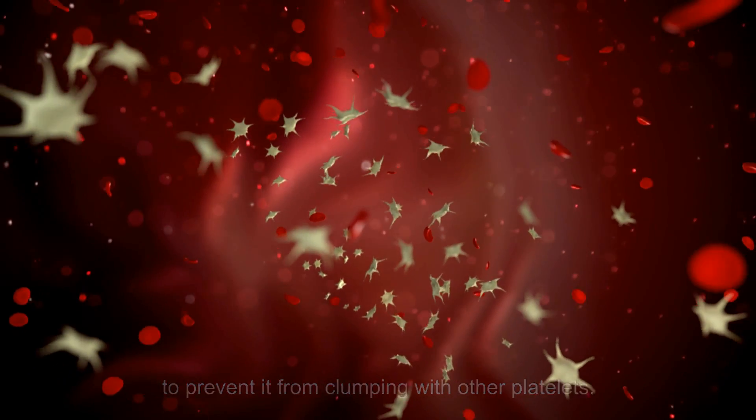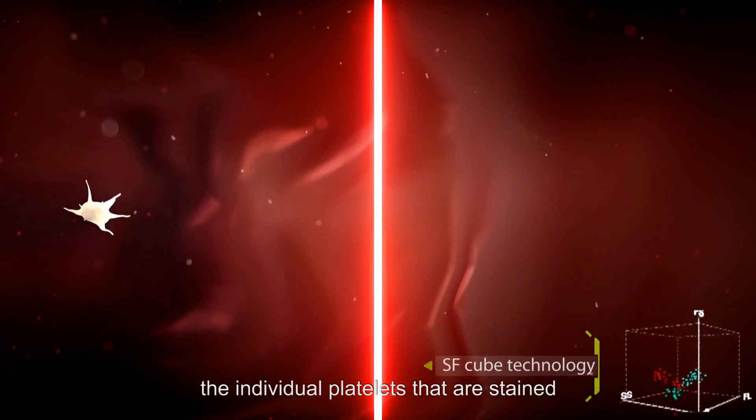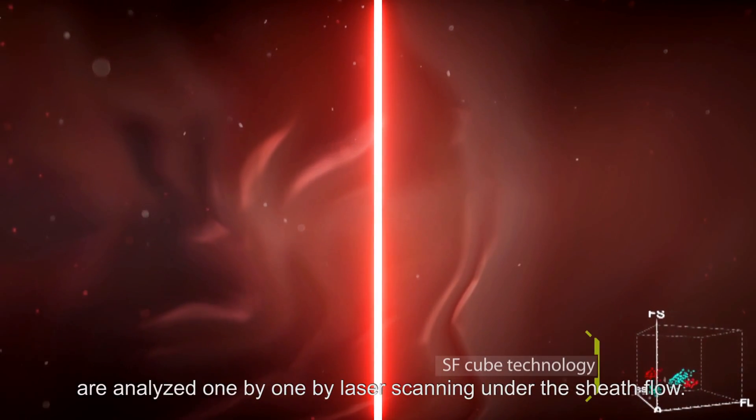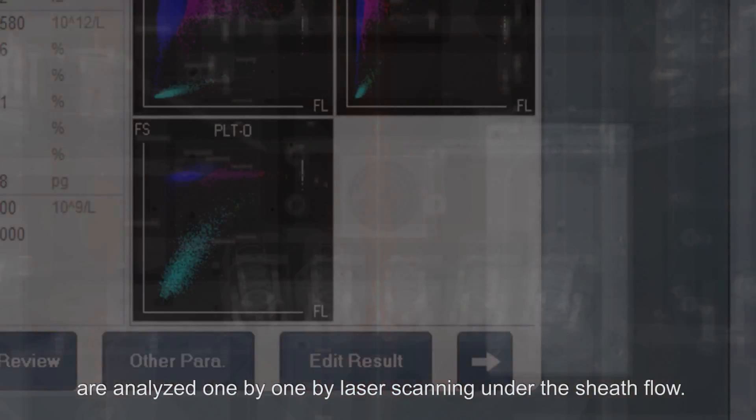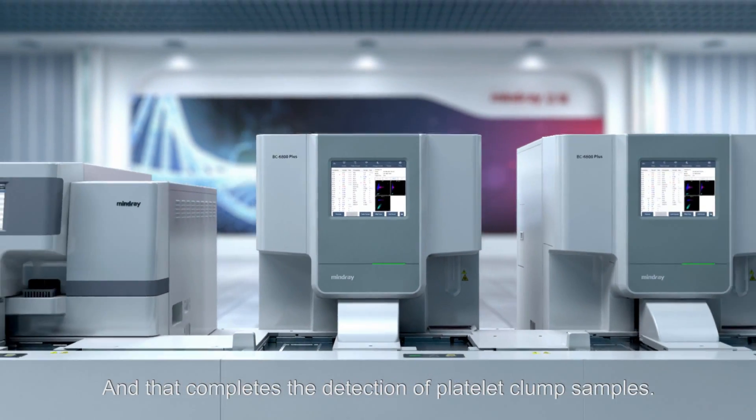Finally, after depolymerization, the individual platelets that are stained are analyzed one by one by laser scanning under the sheath flow, and that completes the detection of the platelet clump samples.